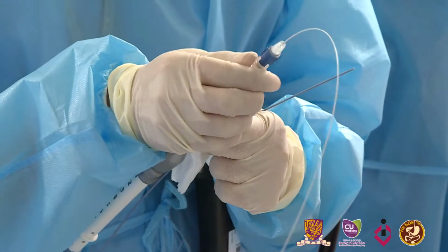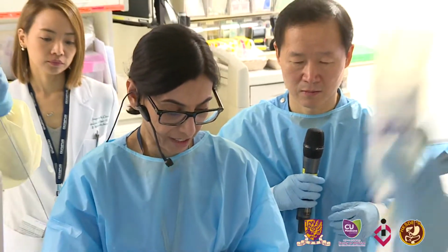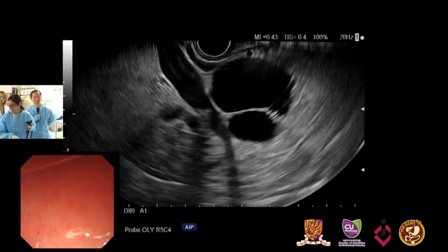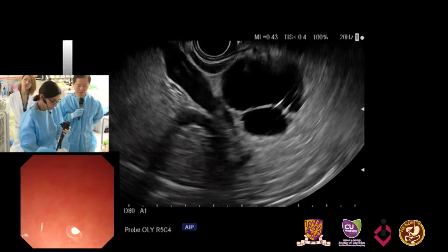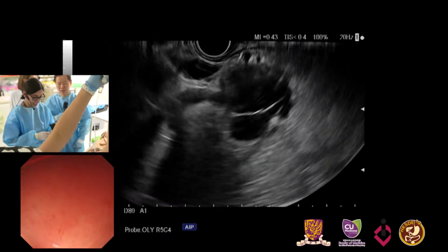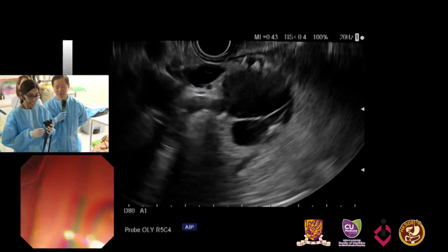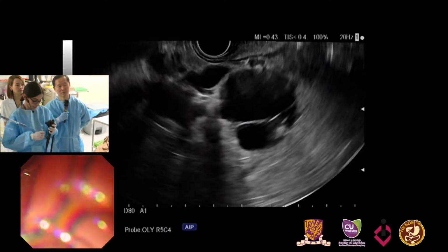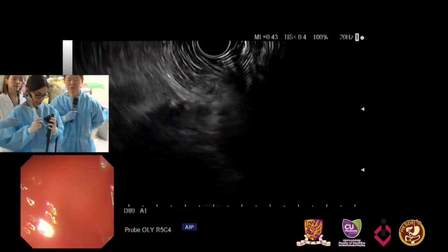And the whole confocal system is based on giving the patient a contrast agent in the IV. We gave the patient IV fluorescein, and then it's taken up by the cells in the lining of the pancreatic cyst. Then we're going to shine a low-powered laser with our probe once we're inside the cyst. The system allows images to be collected through a pinhole aperture, which allows any scattered light to be dismissed from a really high focused image that's about 1,000 times magnification, with about 3.5 microns resolution.